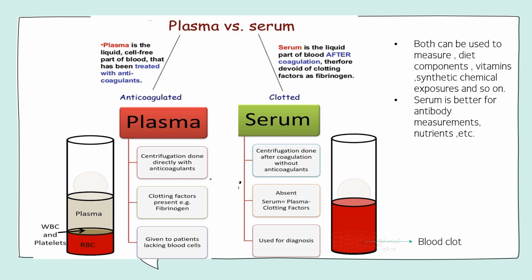In serum, centrifugation is done after coagulation without adding any anticoagulant, and the coagulation factors will be absent, and it is used only for diagnostic purposes.